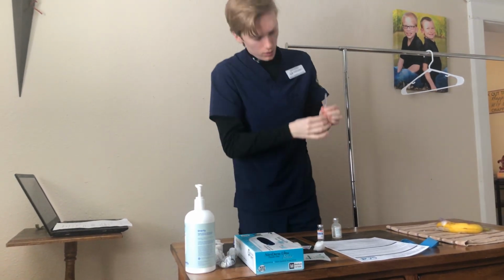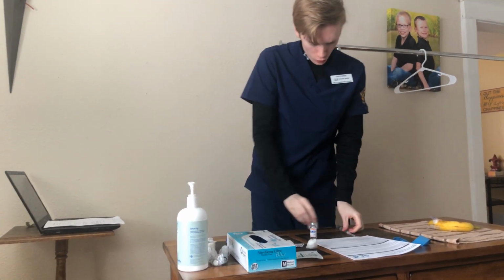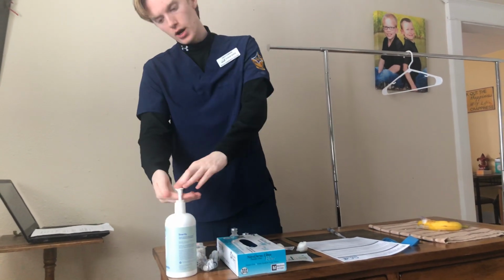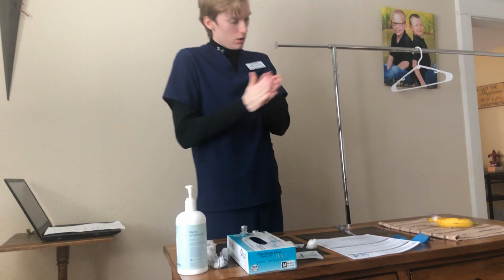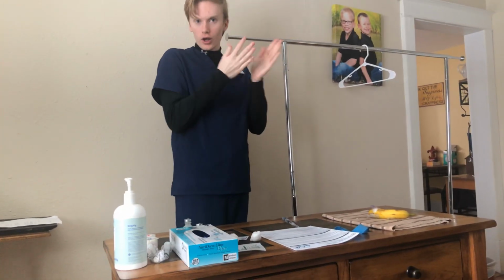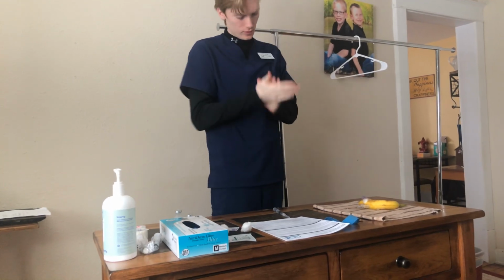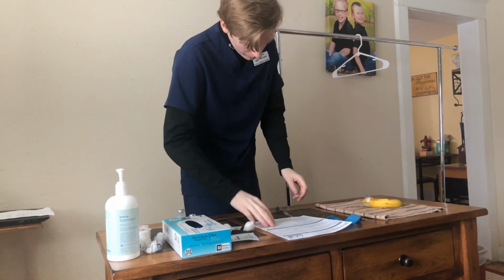Perfect. Alright, now we're going to return to the patient room after I have drawn up the medication. Return the medication to where I got it from, wash my hands. Enter the patient's room, knock knock, hello, I am your nurse again. Can I get your full name and date of birth? Wonderful.